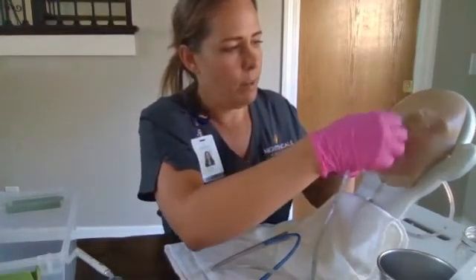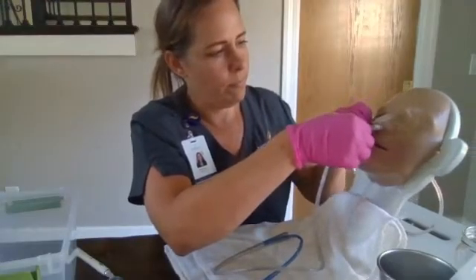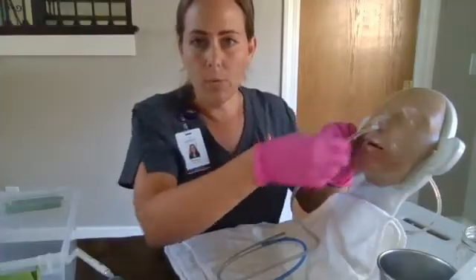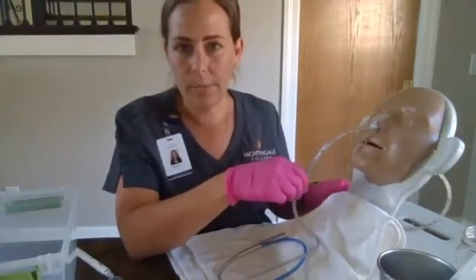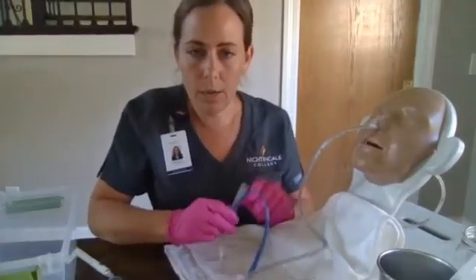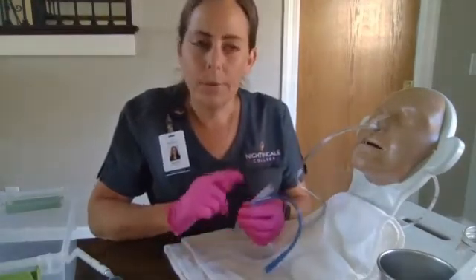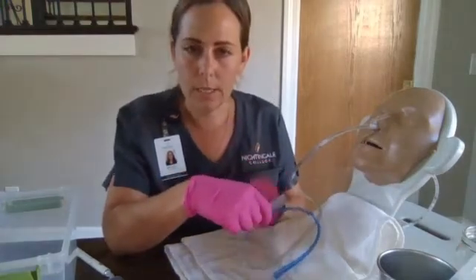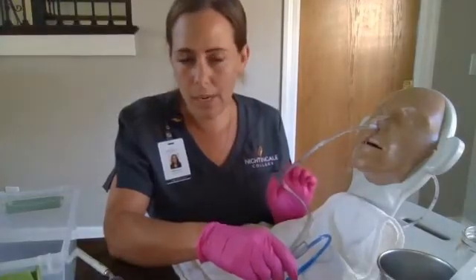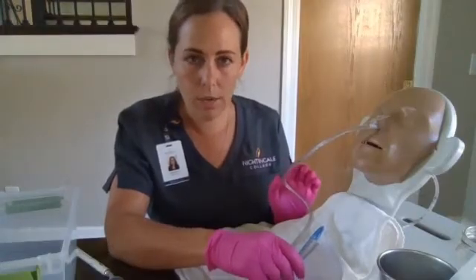We're going to place the tape on the bridge of the nose, wrap it and secure. We'll lower the bed and get an x-ray to verify confirmation that it is, in fact, in the stomach. Once we get that confirmation, we will secure it to his gown with the safety pin and hook it up to our continuous suction. We're going to verify that the NG tube and the suction tube stay unclamped and patent.